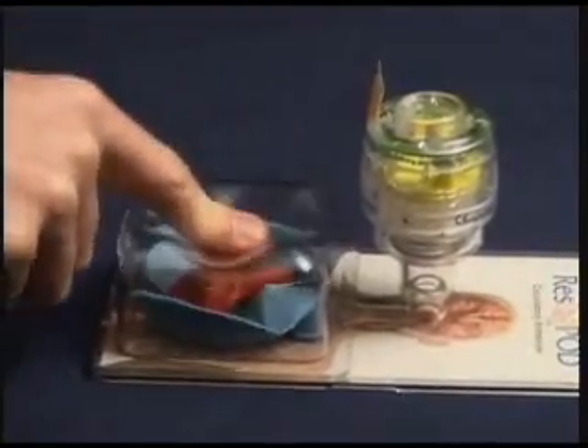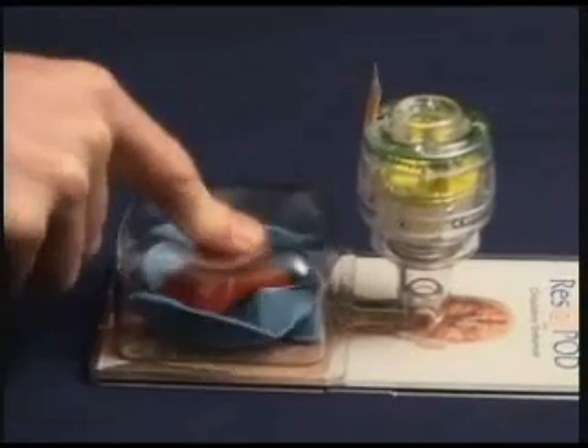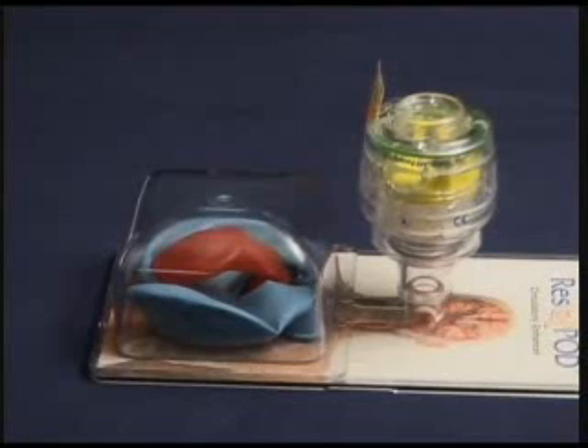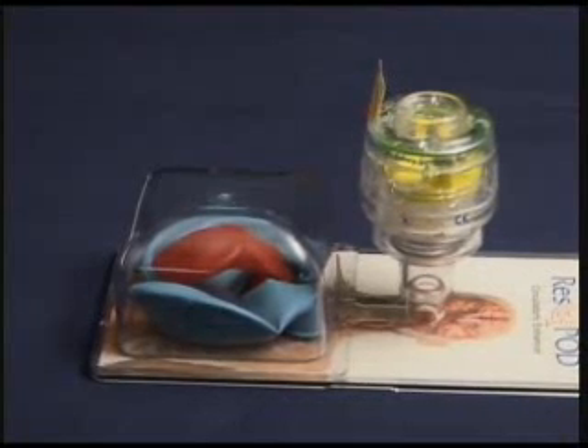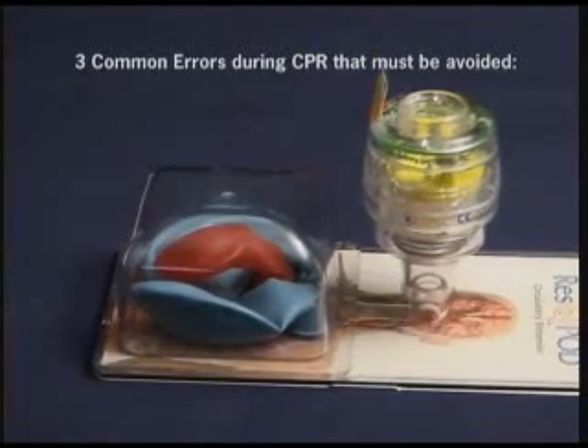The pressures within the brain actually become lower faster when using the Rescue Pod, so there's less resistance to blood flow to the brain. Now that you've seen how the Rescue Pod can be used to augment standard CPR, let's talk about three common errors that are often made during the performance of standard CPR.